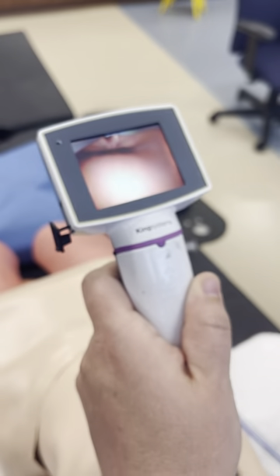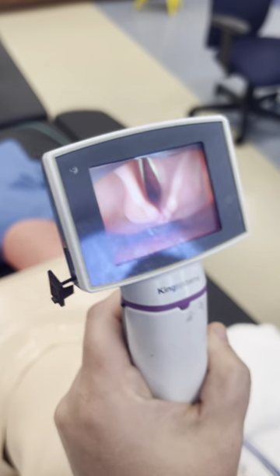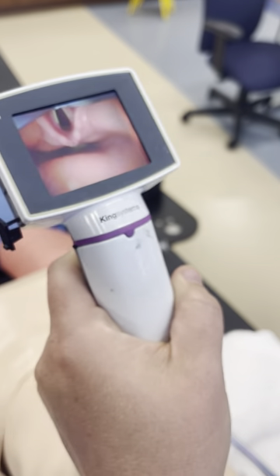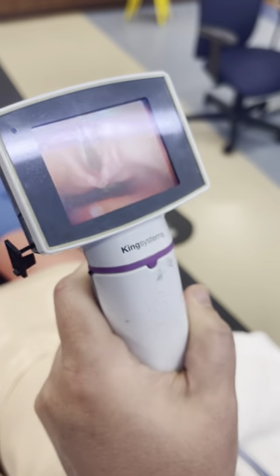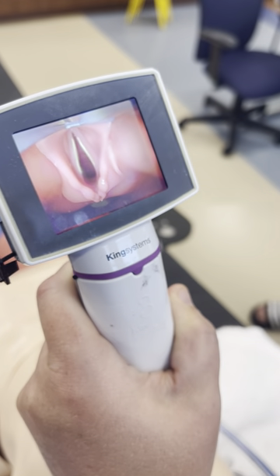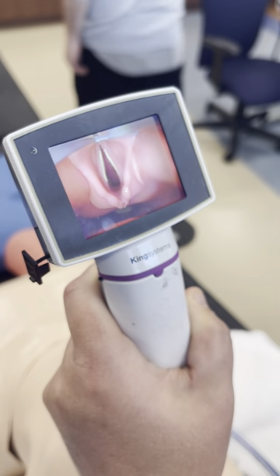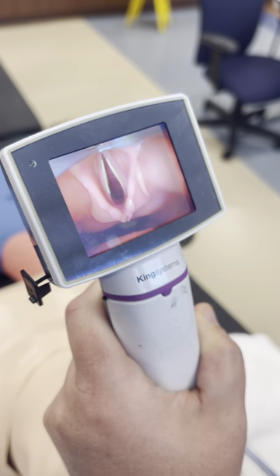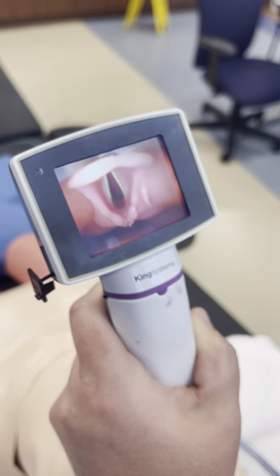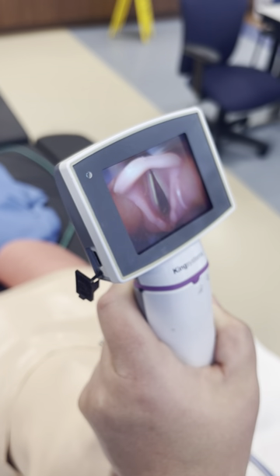If this were a Miller blade, you'd come underneath the epiglottis and lift. The Miller will squish the epiglottis — you go underneath the epiglottis and lift it into the base of the tongue. Whereas with the MAC blade, you walk the blade into the vallecula and look at the epiglottis.